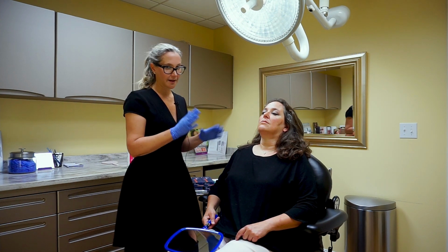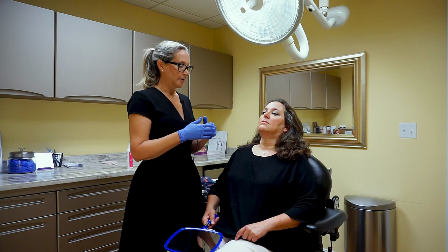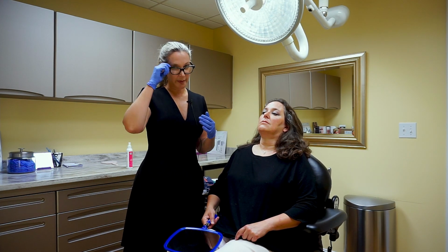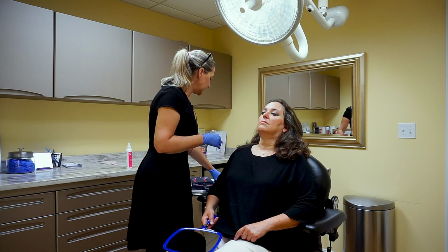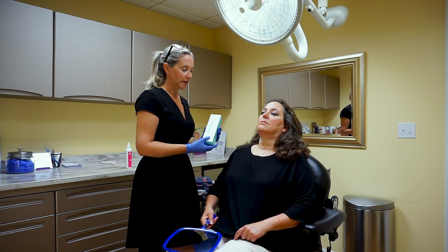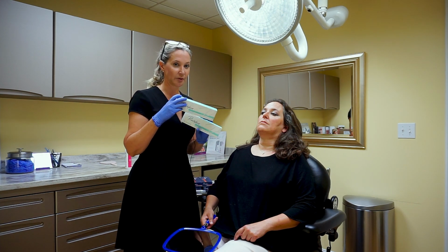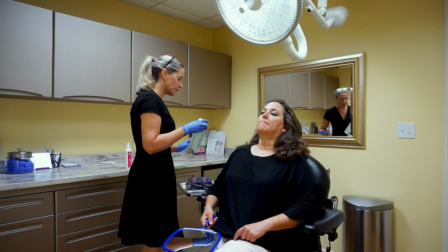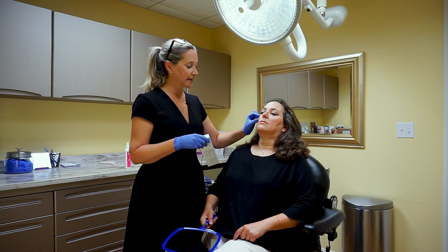When I think of revolumizing a face, I think of building a house. When you build a house, you have to form the scaffolding and make the structure of the house. That's where I start with something like Restylane Lift. This is actually my go-to filler for restoring structural support. So what I'm going to want to do is put some structure back into the cheek.